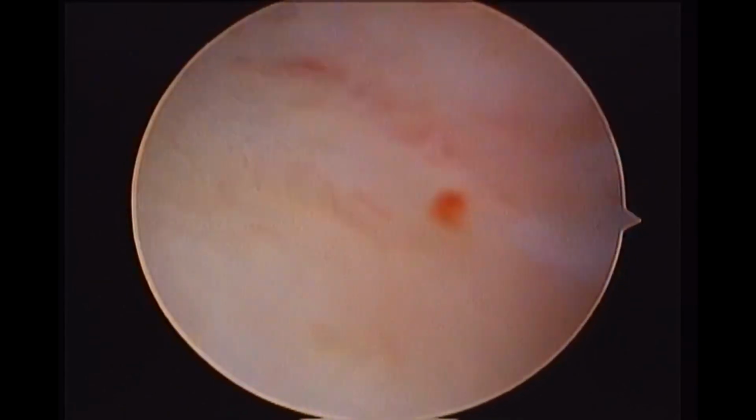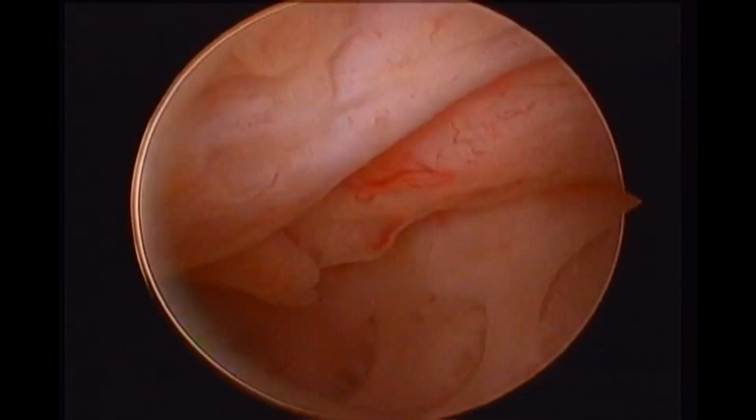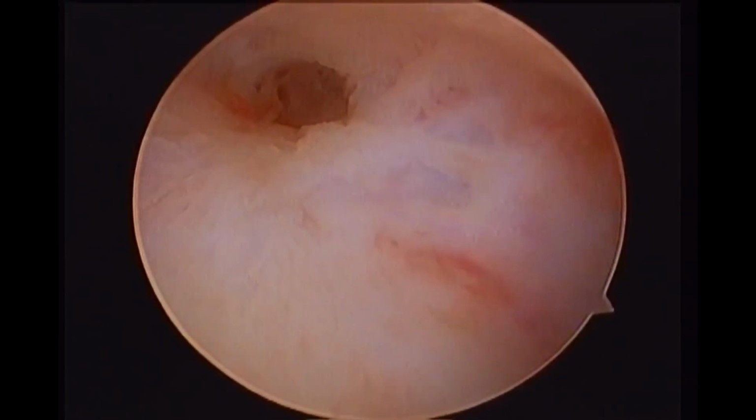Now we are in the cervical canal. You see that the direction of the cervical canal is not straight, so you have to take a little bit of a left turn. If you keep pushing in that direction, you will create a false track. Please look again at how I try to navigate, maneuver to find the direction. So the direction, a little bit to the left side. Yes, this is the internal os.